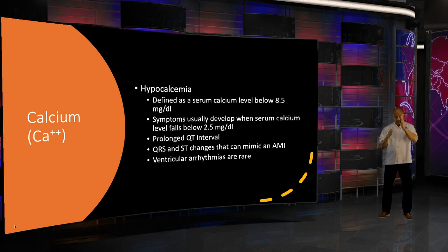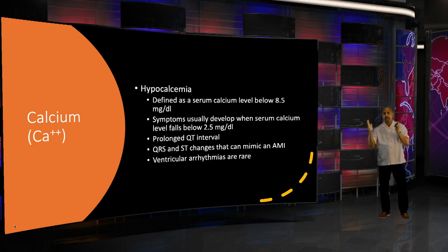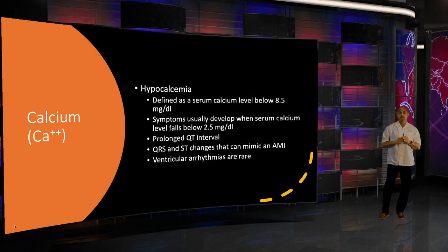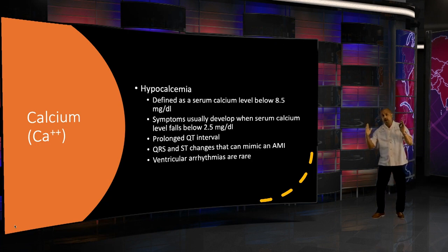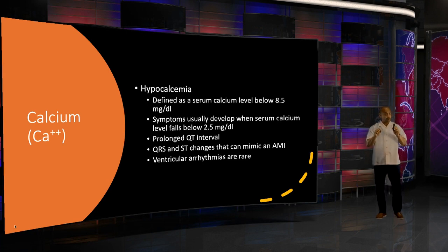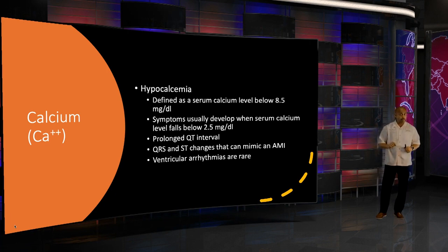So the Q wave, the whole QRS all the way to that T wave, is what we call the QT interval. We're going to start seeing it prolong. So now we start messing with the whole action potential. Those phases, when you shorten or lengthen your QT interval, we start playing with those phases, and we're playing with phases where we have no business playing.